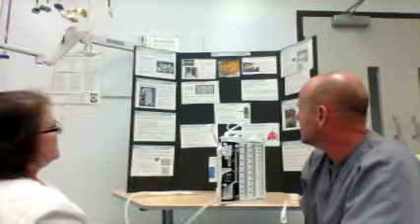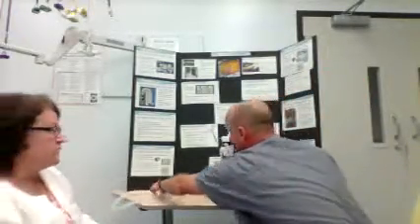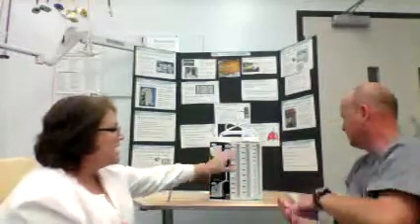All right, so I think we covered everything as far as setting up. We thought we'd go over troubleshooting next with the drainage system. Sometimes when you're doing your assessment and you're looking at the drainage system, you might notice that it doesn't look like there's any drainage, or the drainage is extremely slow.